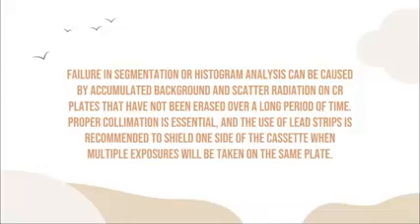Okay, so pag ma-accumulate ganyan ang background radiation, asa man siya na part sa histogram, it is on the tail area sa inyong histogram. And kung scatter siya, nasa before S1 na area. So dapat, when that happens, what ang buhaton? In order to prevent this from happening, limpyuhan ang imaging plate by erasing. Katong mga wala na gamit, i-erase siya before gamiton, for 24 to 48 hours. Itong mga 24 to 48 hours na wala na gamit, i-erase. Proper collimation is also essential para mag-minimize ang inyong scatter radiation.